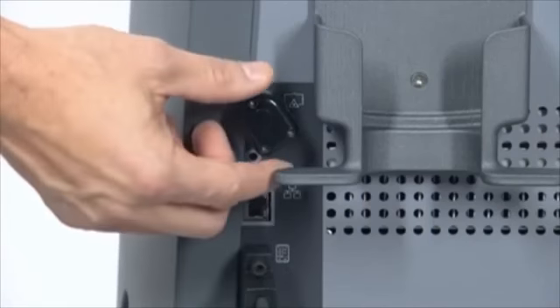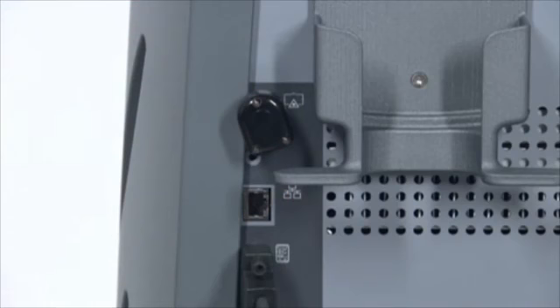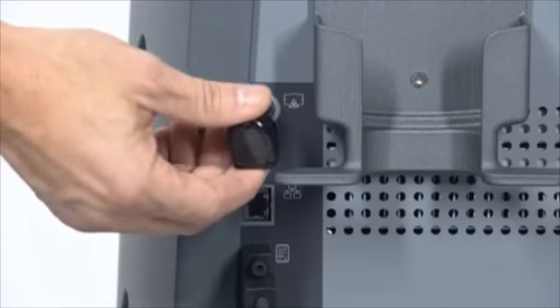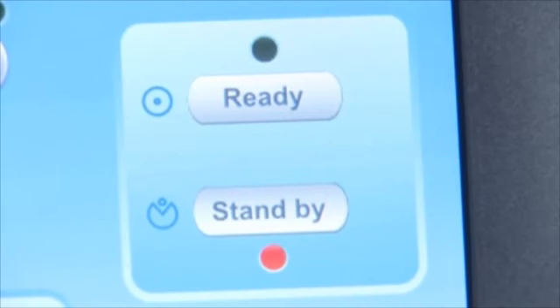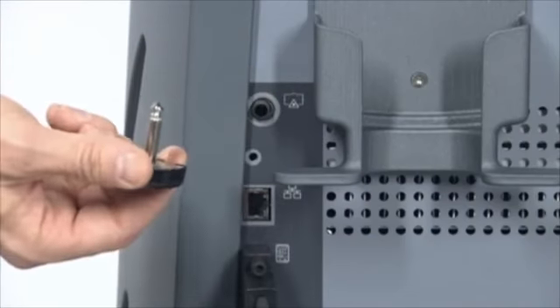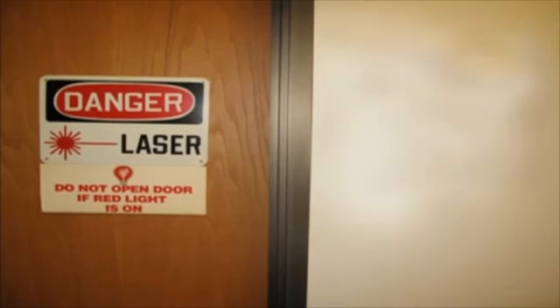The external door interlock is a safety feature that disables the laser if the treatment room doors are opened or the interlock plug is removed. Use of an external door interlock is optional. However, you must insert the interlock plug into the interlock receptacle whether or not you are using an external door interlock. The laser remains inoperative until the plug is inserted into the receptacle. When using an external door interlock, the laser automatically disables and returns to standby mode if the treatment door is opened or the interlock plug is removed. The following illustration displays on the control screen. To resume treatment, close the treatment room door or reinsert the interlock plug, and press the ready button.